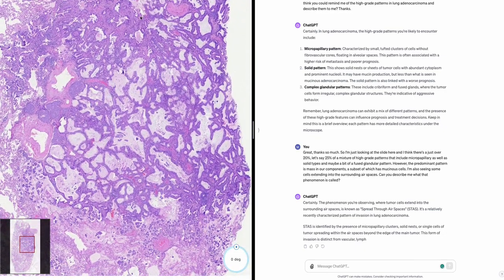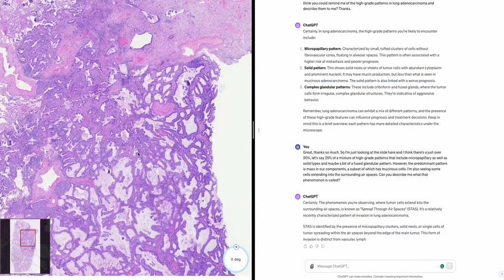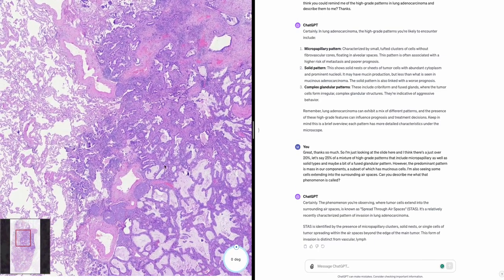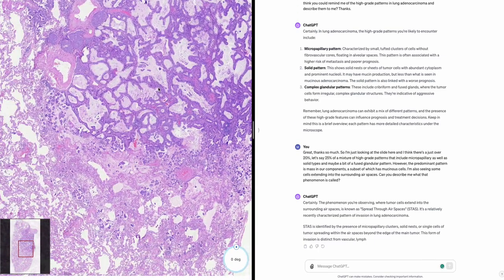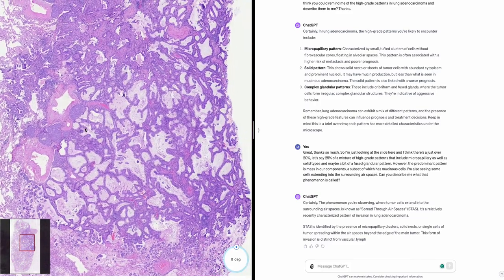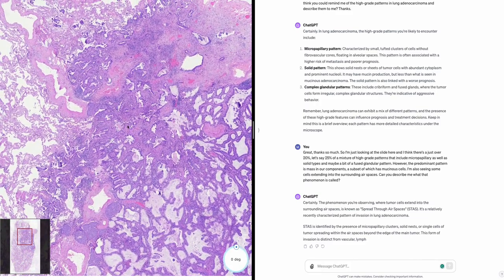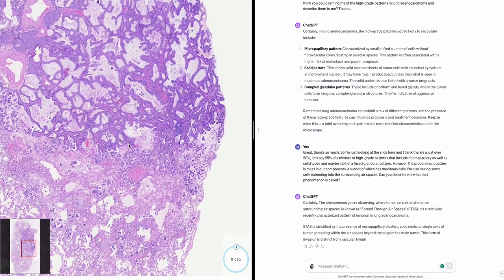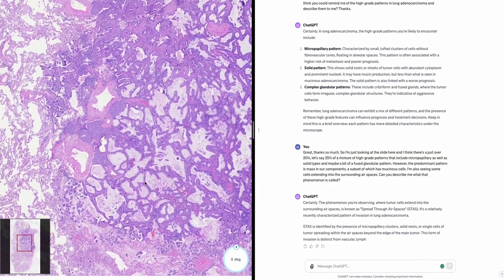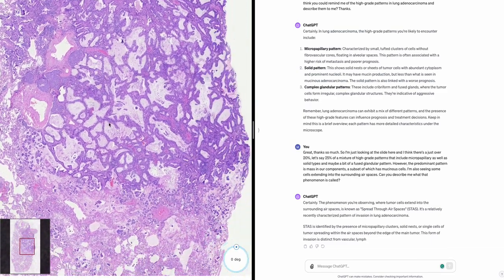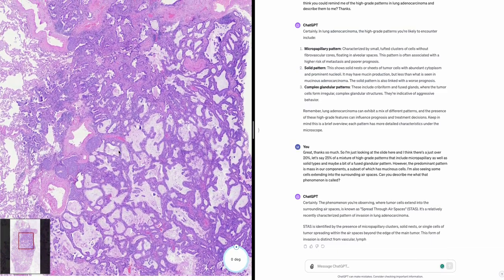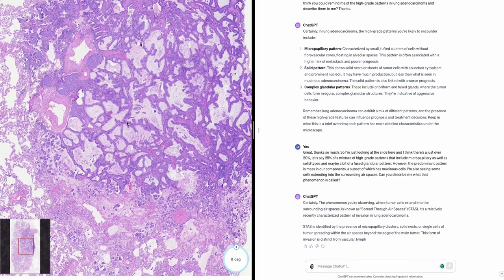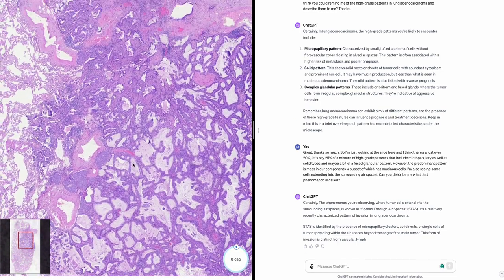Looking at the gross description, the tumor is 1.5 centimeters in greatest dimension and involves the visceral pleura. Can you put this all together into a pathology report including a microscopic description and T-stage calculation? I've previously examined lymph nodes from positions 12R, 11R, and mediastinal — all negative for malignancy.